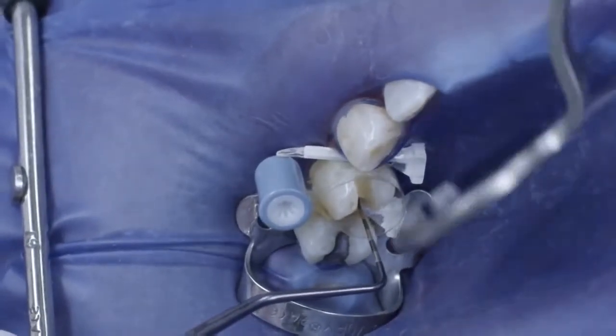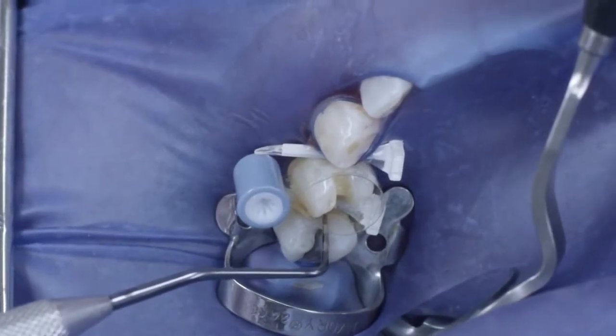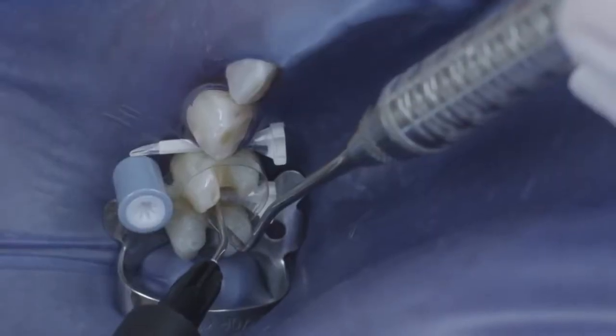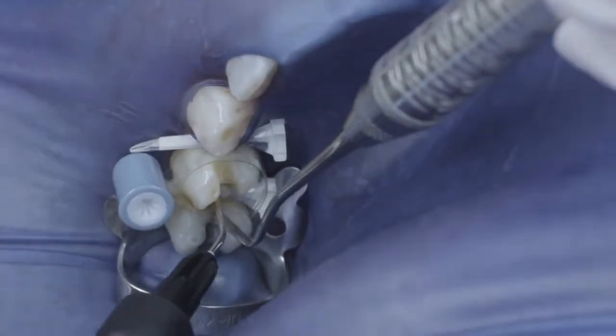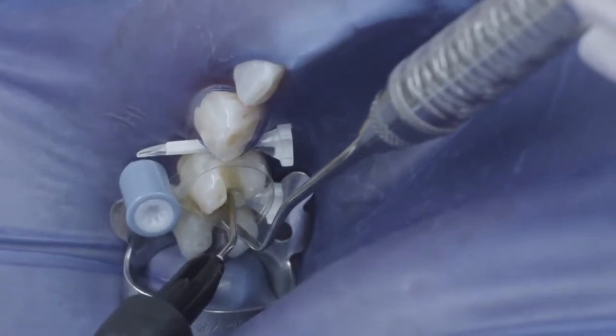The depth of the cavity can be measured using a periodontal probe. Venus Bulk Fill can be cured up to a layer thickness of 4 millimeters. It was placed in the cavity starting from the deepest point of the proximal box.